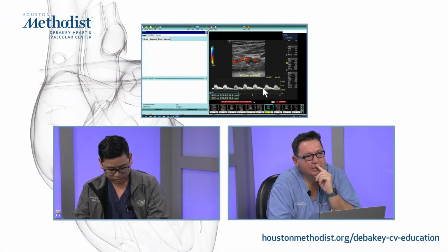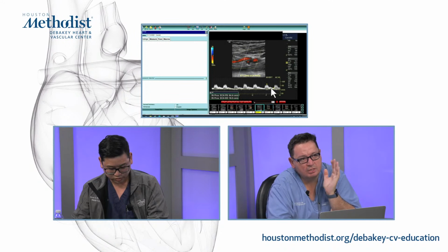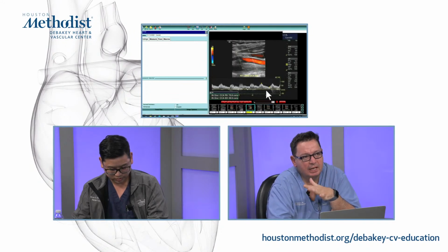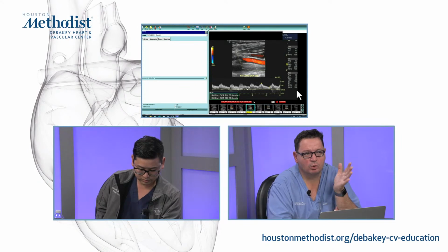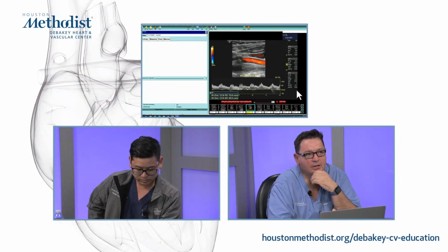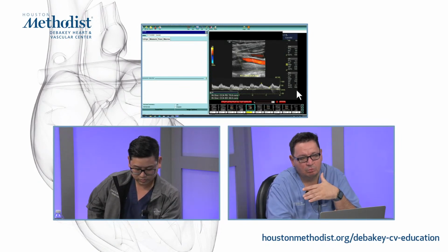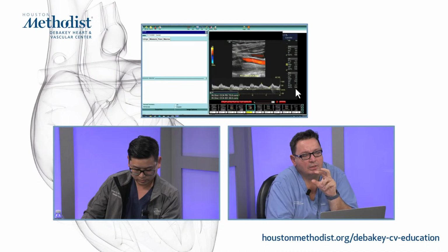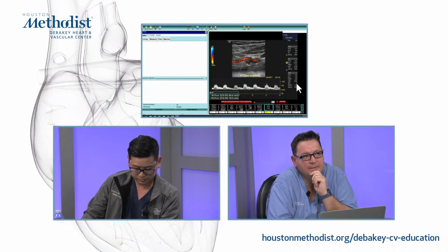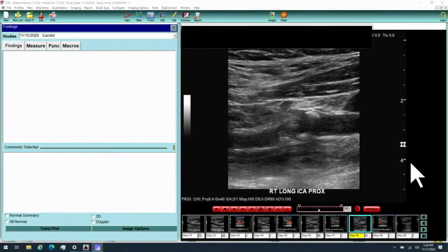And if you can go back just to the distal CCA signal, the systolic upstroke started to delay. And I think this is where we call it a little bit dampened signal for sure. And for me it's stunning that the sonographer picked the ECA. After the ECA, definitely we'll see the ICA signal, but I want you guys to remember these three signals. So this distal CCA signal shows the ECA and shows the ICA. I see, here we go.